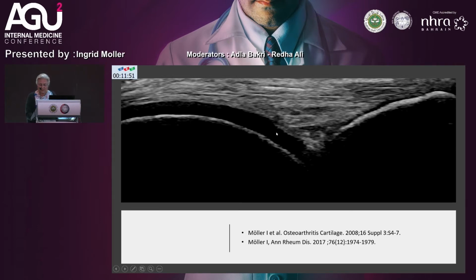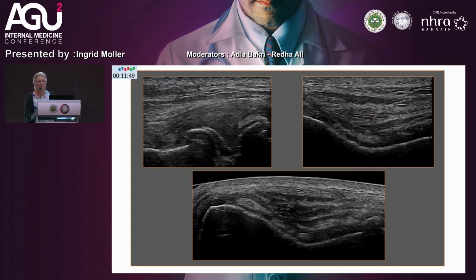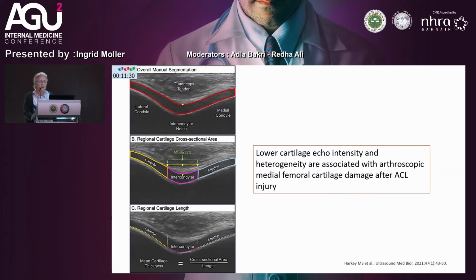And water is the main component of the cartilage. So we can identify the cartilage by ultrasound, and the image of the cartilage is clear, as it is clear that the cartilage can have pathologies different from osteoarthritis, and we can differentiate them by ultrasound. And this is the case of these patients having CPPD disease.